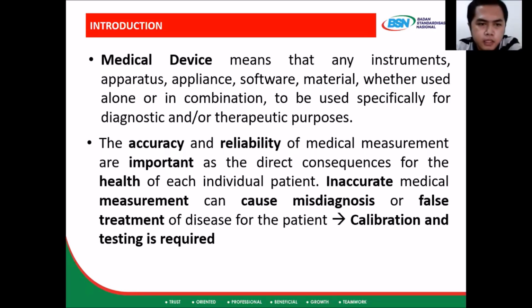Well, the accuracy and reliability of medical measurement are important as the direct consequences for the health of each individual patient. Inaccurate medical measurement can cause misdiagnosis or false treatment of disease for the patient. This is why calibration and testing of medical devices is very important and very demanding.